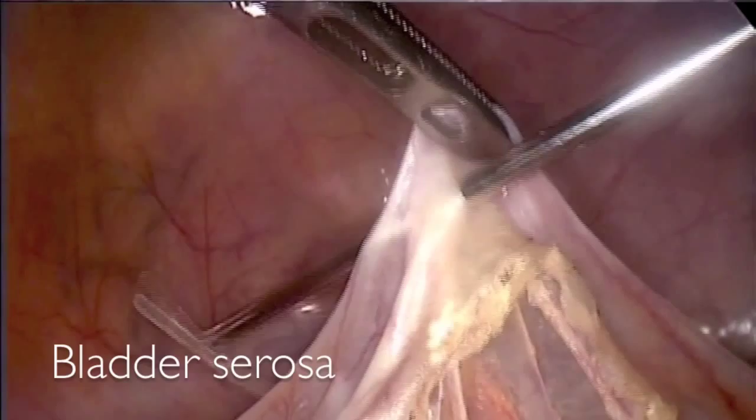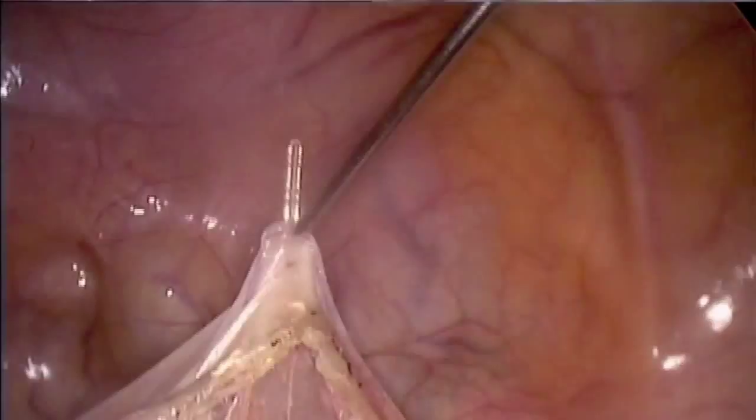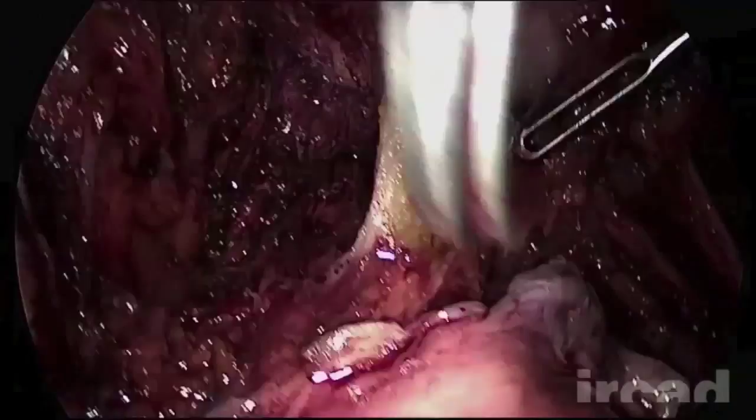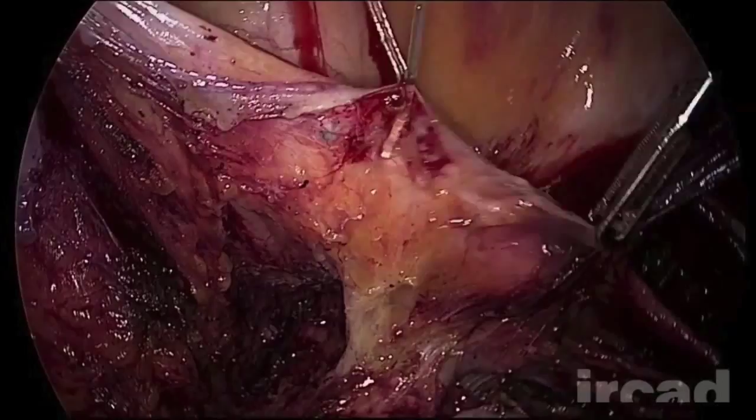The bladder can be suspended either by the peritoneum or directly from its muscularis layer. This technique is useful in radical hysterectomy, particularly in difficult cases when tissues are inflammatory or fibrotic after cone biopsy. The traction exerted by the T-Lift device improves exposure, facilitating the dissection of the anterior parametrium.